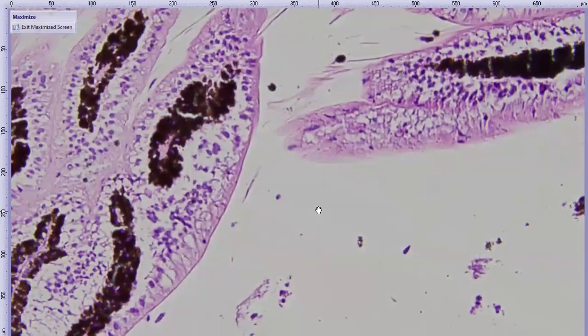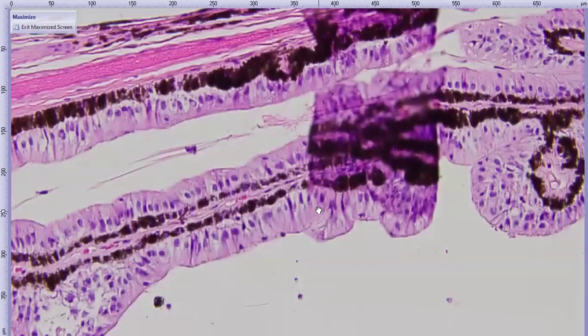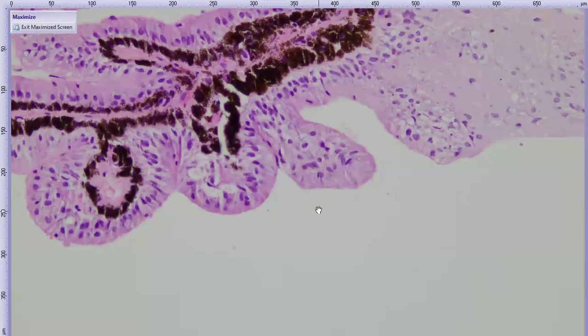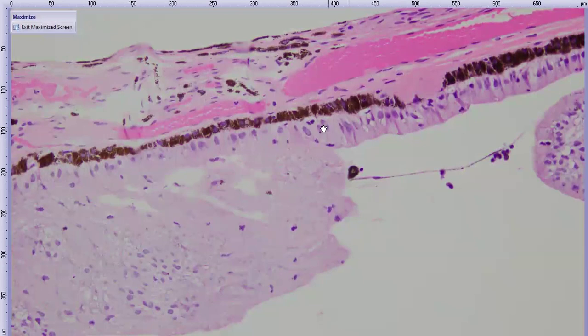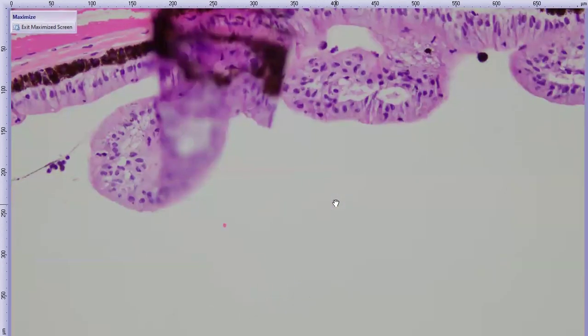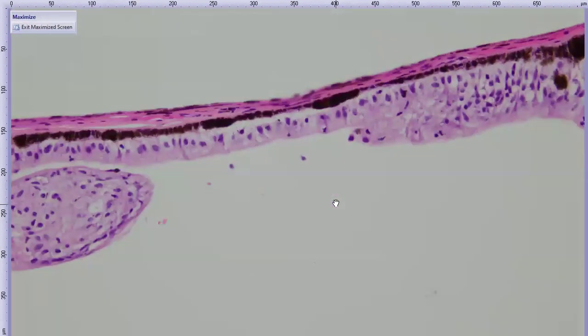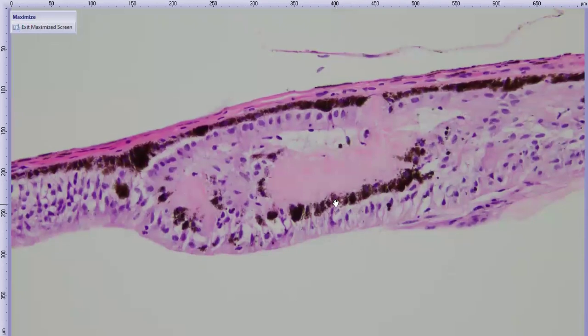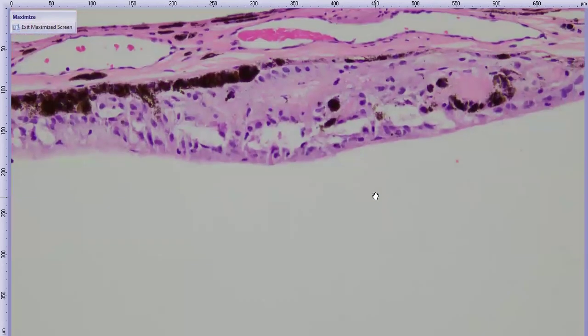There was a diagnosis of equine recurrent uveitis, and often what we see is accumulation of amyloid on the surface of the ciliary body. Again, not the best example, but it might be a little bit of amyloid material there. I'm not very convinced myself. Oh, that's better, right here. So some amyloid as a non-specific inflammatory response in these eyes.